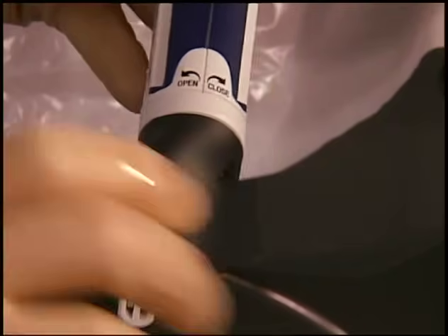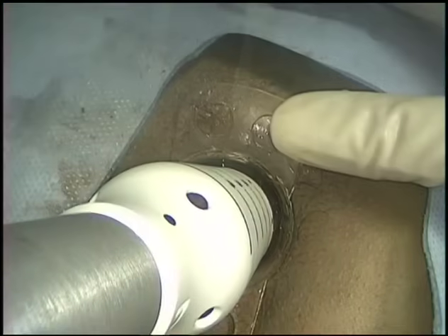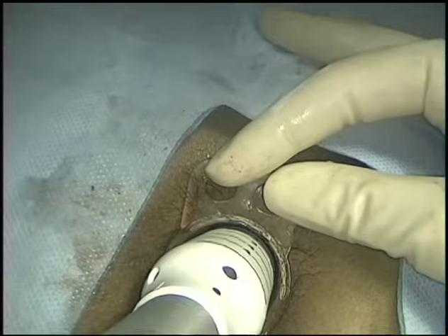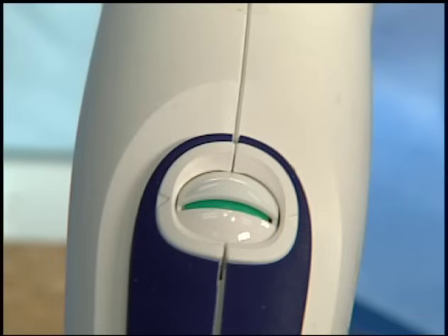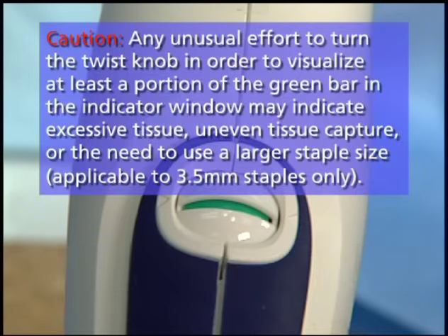Close the device by holding it perpendicular to the opening of the anus and turn the twist knob in the clockwise direction. Allow the device to close with neutral tension. Continue to twist the knob clockwise until the ready-to-fire indicator displays a green line. The safety will not release if the green ready-to-fire indicator is not visible. Do not turn the twist knob once the safety is released. Any unusual effort required to turn the twist knob to visualize at least a portion of the green bar in the indicator window may indicate excessive tissue, uneven tissue capture, or the need to use a larger staple size.